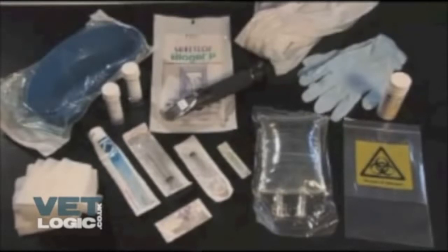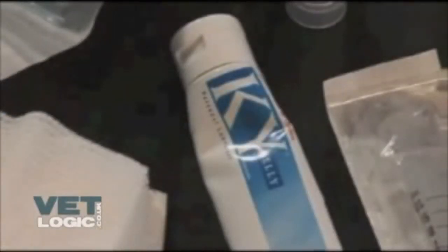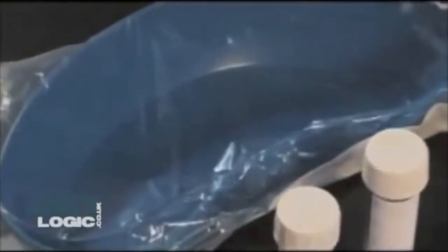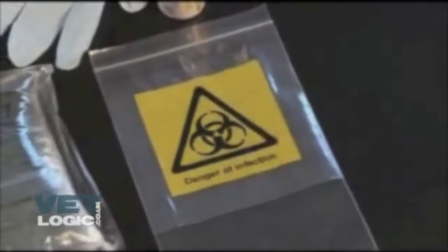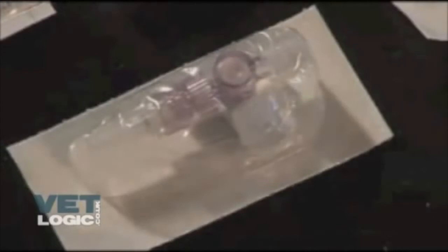Keto sticks, biohazard bag, syringes, needles, three-way tap, refractometer. Swabs to clean the area for catheterization. KY jelly to lubricate the catheter before insertion. Sterile kidney dish to collect the urine. Sterile gloves. Refractometer to test the specific gravity of the urine. Apron to wear to protect clothing. Non-sterile gloves to wear to protect hands. Keto sticks to test glucose and ketones of the urine. Biohazard bag to send urine sample to the lab for testing. Sterile saline to flush the bladder. Syringes and needles to draw up the saline. Three-way tap to use when collecting a urine sample from the catheter.